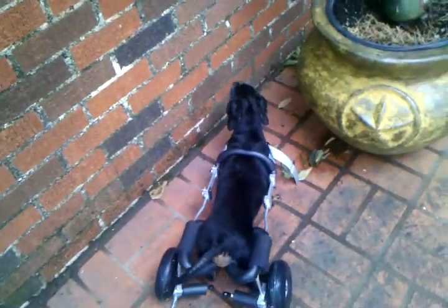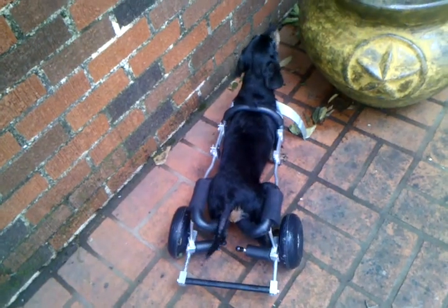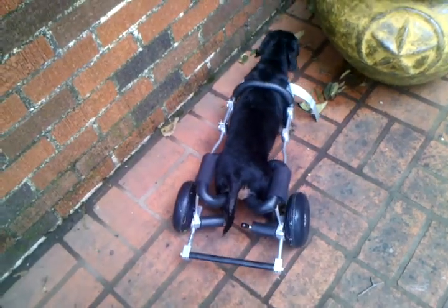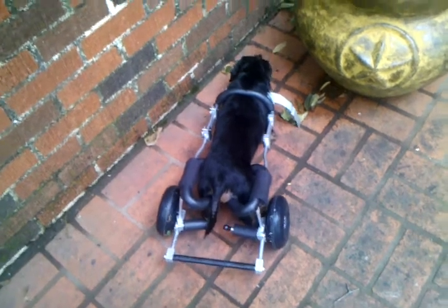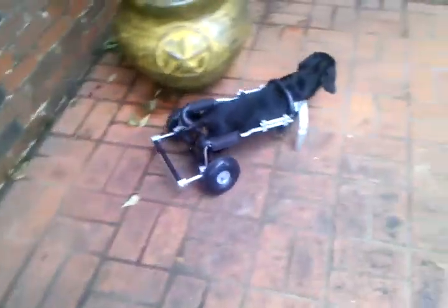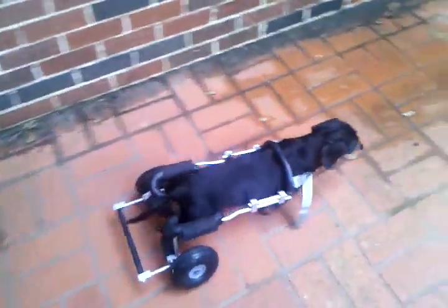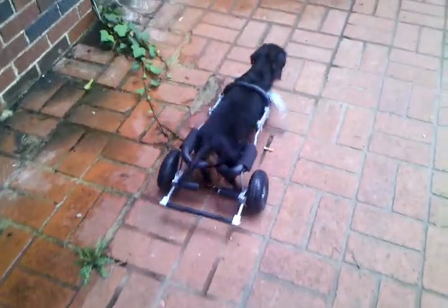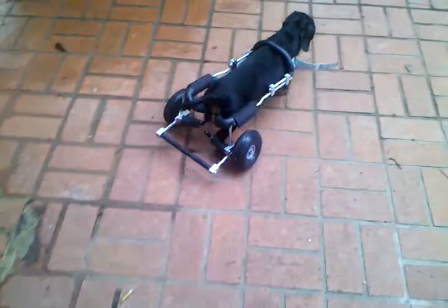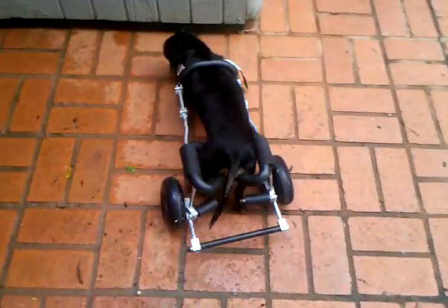Moving those legs now — those other things back there behind the legs are called rolling stirrups. If we're going to be walking a bunch, I can put her feet up there and she won't drag. So you're using those little legs in this wheelchair.